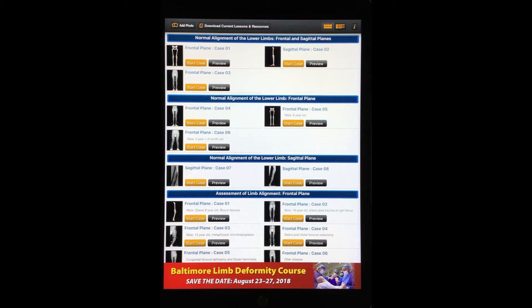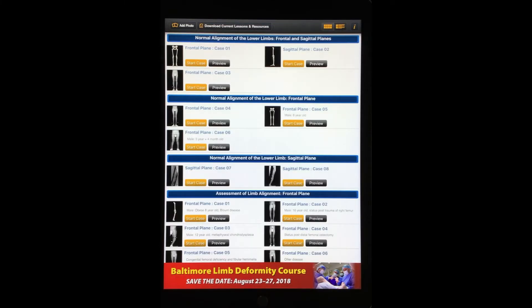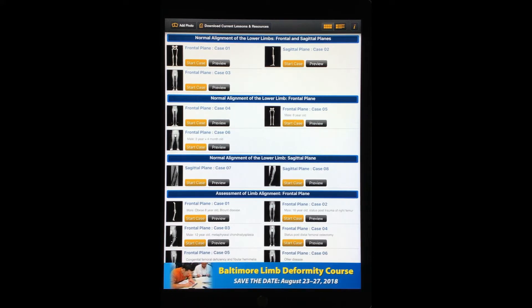After you purchase Bone Ninja, the app will download and will include several case examples. The remaining cases can be downloaded by pressing the Download Current Lessons and Resources button on the main menu toolbar. A Wi-Fi connection is required to complete this task. We will update our case examples periodically, so press this button regularly to download the most recent case examples and solutions.